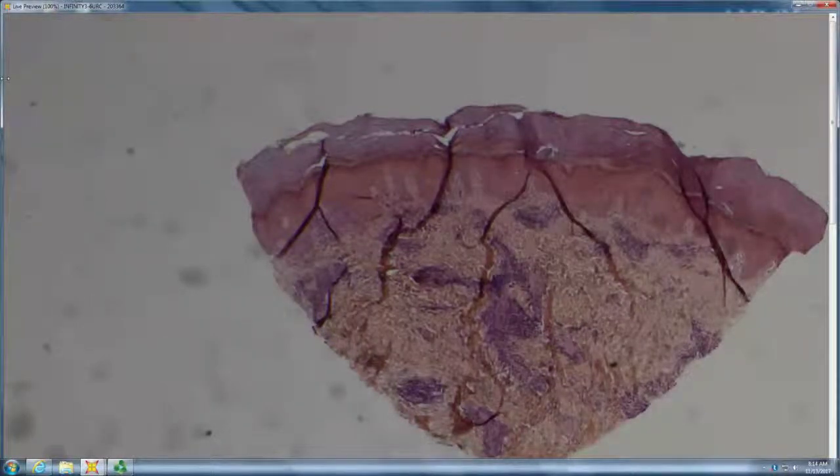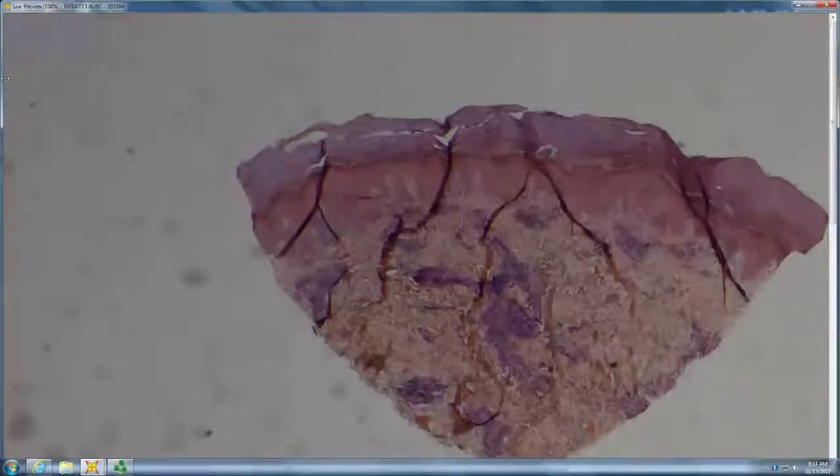Lots of extravasated reds, with lots of inflammation, right? Nope, no inflammation. Oh, I got that wrong. Okay, if there's no inflammation, then what's your differential? Senile purpura versus some kind of thrombocytopenia. Yeah, and the next thing you do is look at the vessels. Any thrombi in the vessels? They look pretty clear. Yeah, vessels in this are clear as a bell.